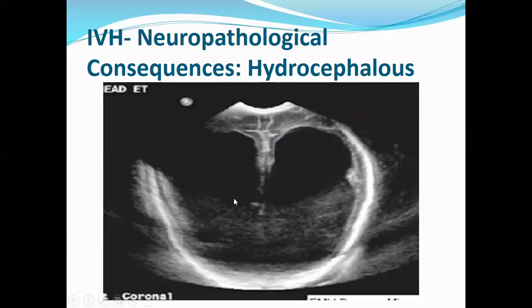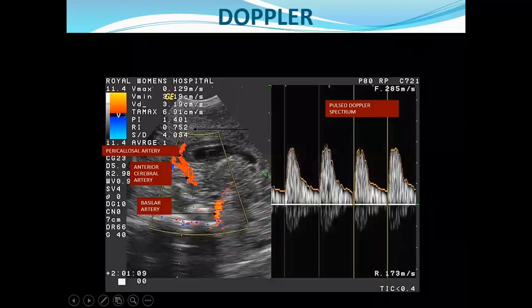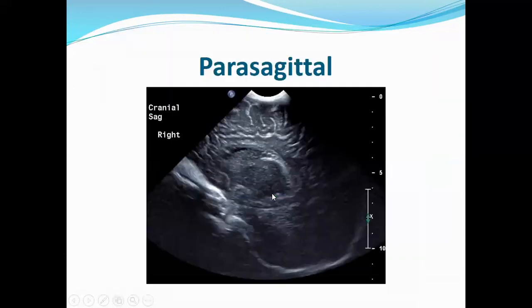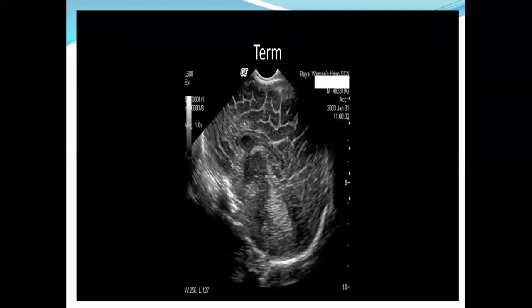They will be impaired in the absorption of the cerebral fluid, or there will be a block somewhere here, just above the fourth ventricle, this aqueduct of Sylvius. That's a common area for that block.